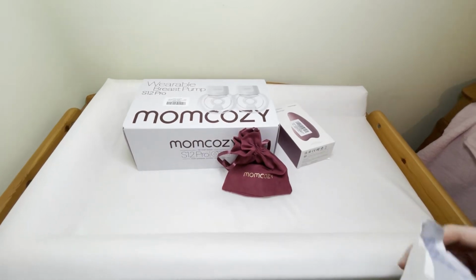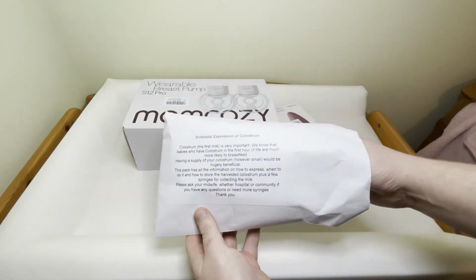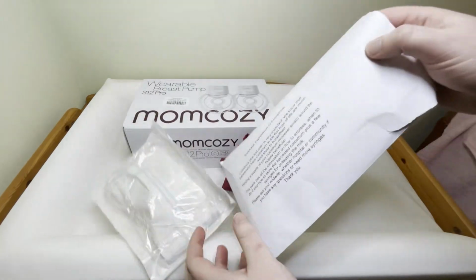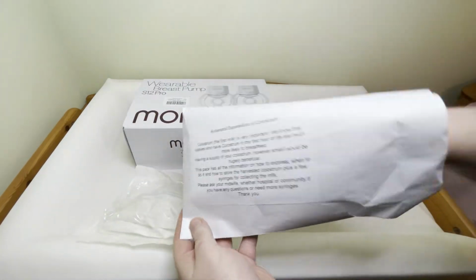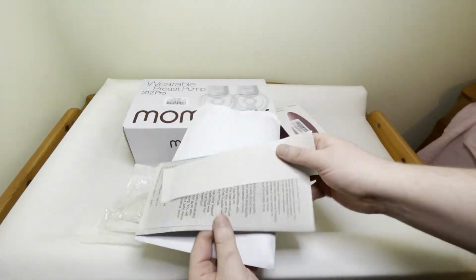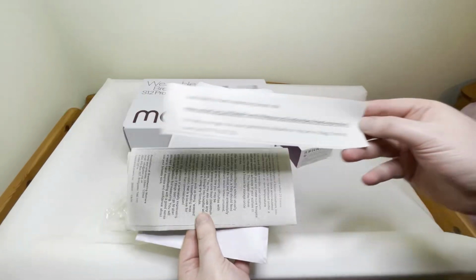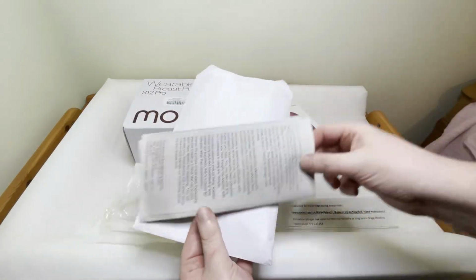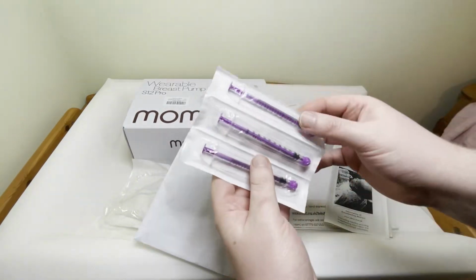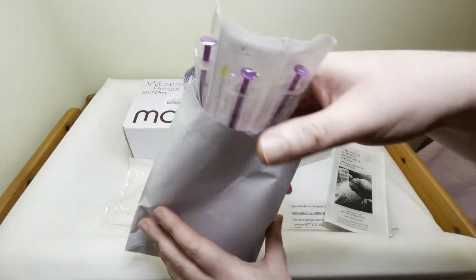To help us along with that, we have been given a kit by our midwife. Now, I have seen that these get sold online, but just don't do it, because you can get them from your midwife for free here in the UK. There's a helpful resource, a little bit of a leaflet, and the little syringes, so you freeze them once you've collected some.